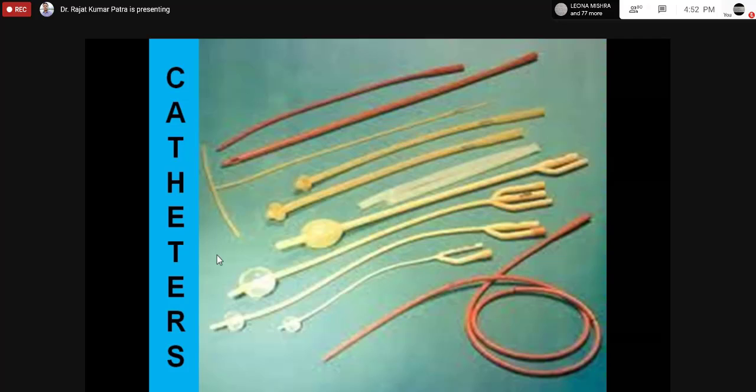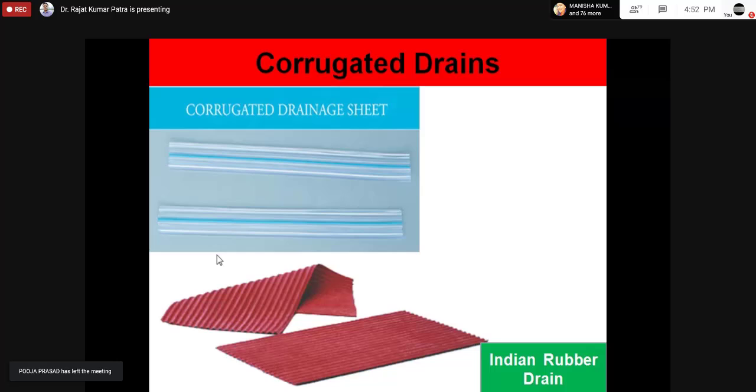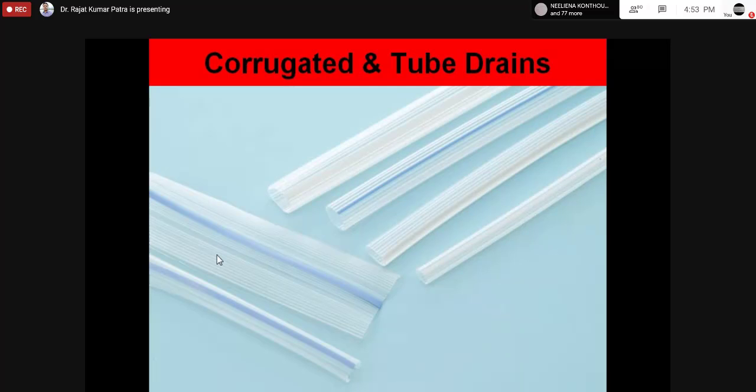These are all different catheters, okay. Mainly you get a Foley's catheter and a Ryle's tube, okay. Sometimes suction may or may not be there. Corrugated rubber drains, okay. These are all used for drainage purposes. But nowadays we use Romovac drain, so these are not used. Corrugated rubber drains are mainly used in hydrocele cases, after post-op to prevent hematoma. Different types of corrugated drains.